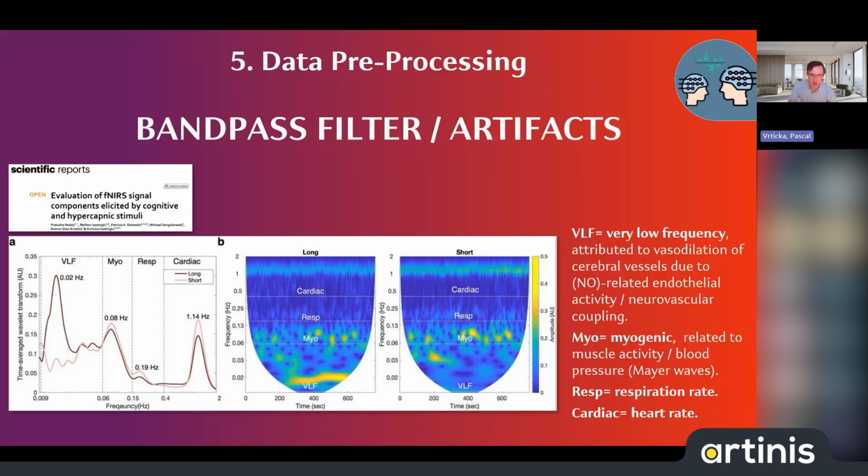And this is especially the case for high frequency noise, for example the cardiac signal, but also for medium frequency noise, so for the respiration and the Mayer waves, right, which are related to muscle activity or blood pressure.